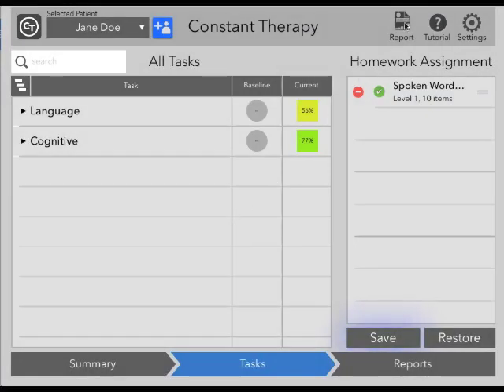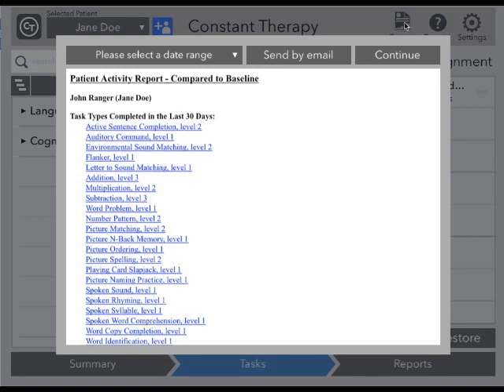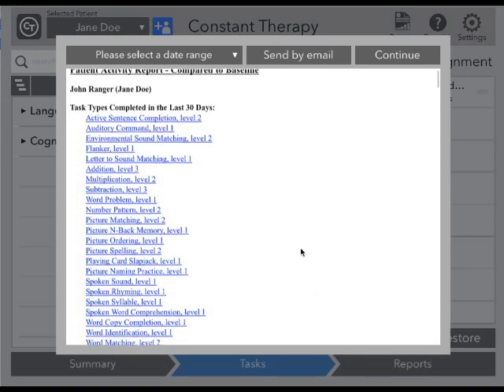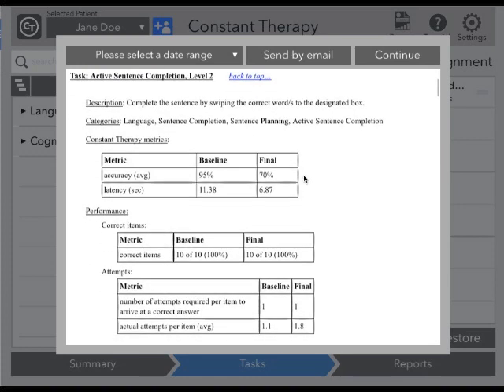The report icon on the top right of the screen allows you to create and distribute reports for the patient that you have currently selected. Each report will contain a description of the tasks that the patient has performed, as well as detail about the patient's performance on four metrics: accuracy, latency, cues, and attempts.